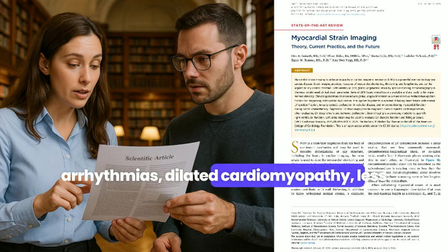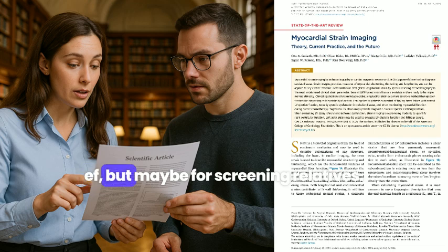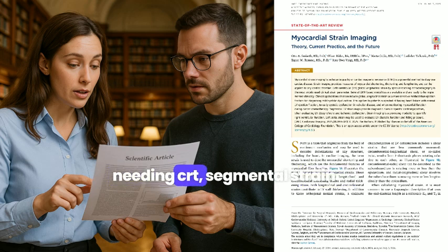Dilated cardiomyopathy, DCM. Less role in diagnosing obvious DCM with low EF, but maybe for screening relatives. In patients with conduction delays needing CRT, segmental strain and work analysis can help predict response, similar to LBBB.